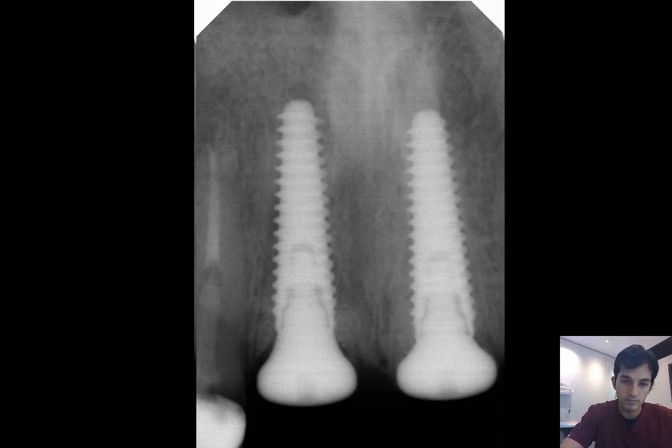And what I notice from cases I've done with customized acrylic healing abutments is that 2 or 3 months later, when we remove that healing abutment, you get a lot more smell, a lot more bleeding coming out in those cases where there's an acrylic in connection with the tissues, as opposed to the titanium, which just heals beautifully around it. So yeah, that's why I use the titanium healing abutments in these cases.